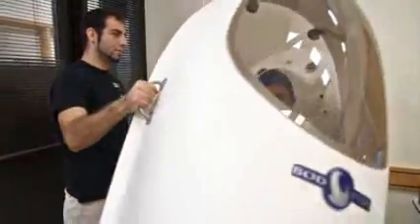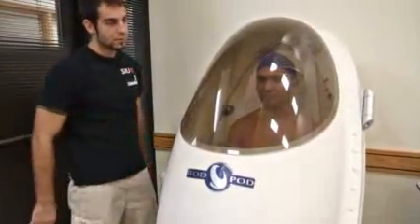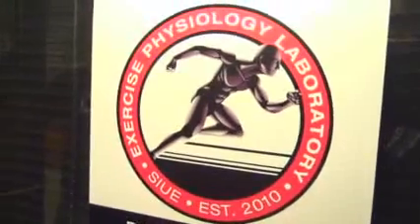As you can see, the Bod Pod is a great tool for comparing body fat to lean mass. It works with many populations and is one of the safest, fastest, and most accurate ways to measure body fat. Try it now in the Exercise Physiology Lab at SIUE.